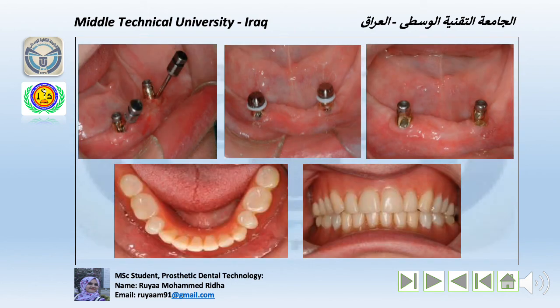After correcting the angulation of the abutments in the laboratory, they are sent to the clinic, where the dentist inserts them and torques them to 20 Newton centimeters. Also, insert the locator cap with the black processing male into each locator implant abutment, leaving the white block-out spacer beneath.